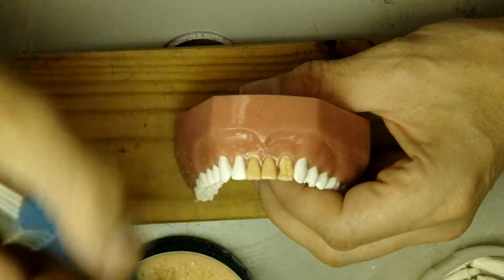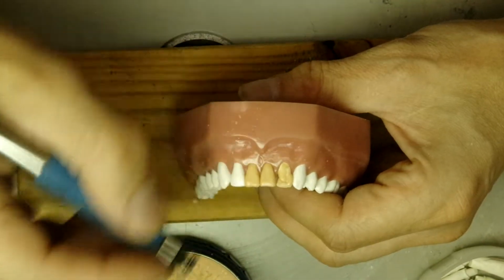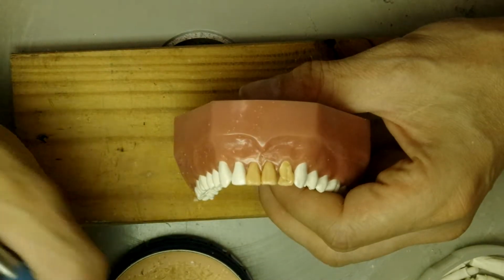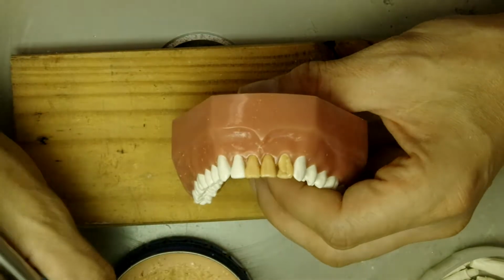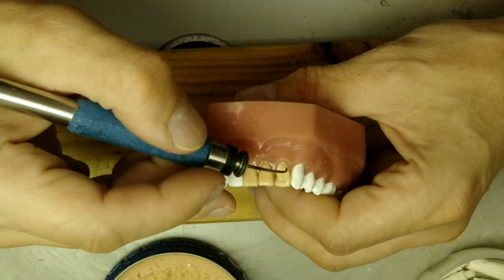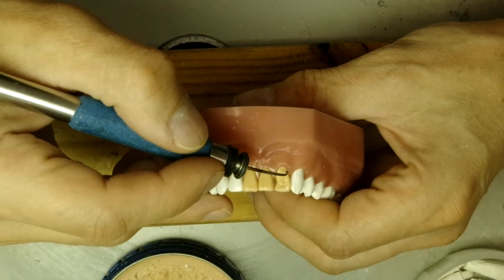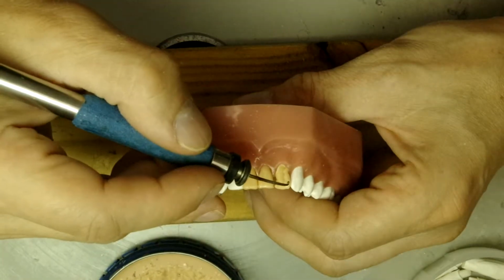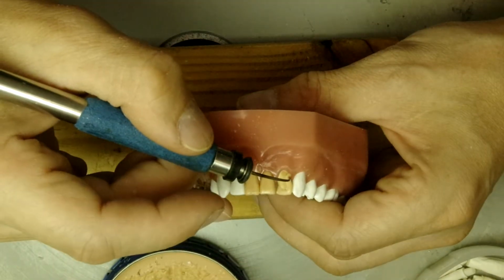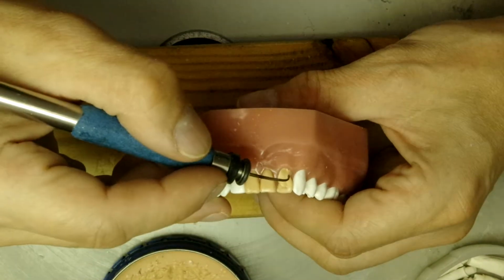So now we're waxing the distal labial line angle. I meant to say distal labial line angle, not the distal. If you're referring to the distal area, then you say distal. If you're referring to a specific location of the line angle, or the line angle itself, you say distolabial line angle. So we have a curvature right here, and then it curves in, and then it curves back down when you get to the gingival.